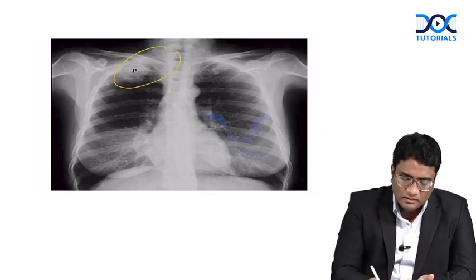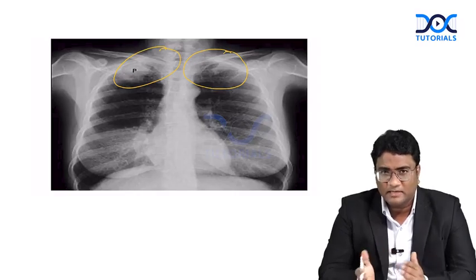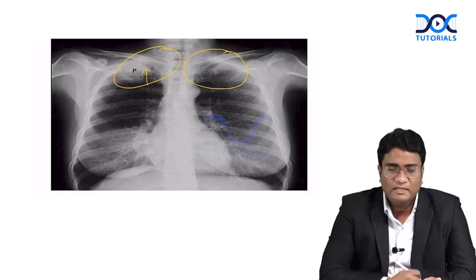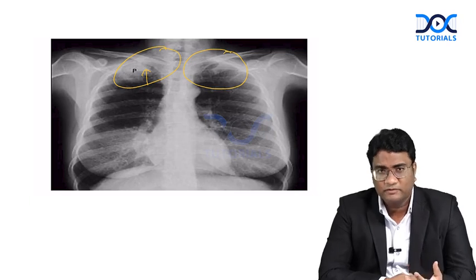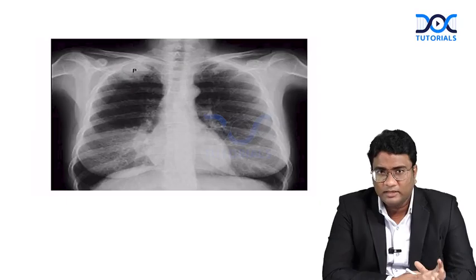So if you can see here, look at this. If you are not concentrating well while seeing the radiograph, you will miss this opacity. But if you follow the protocol, you look at the lung zones, apical zones, upper zones, middle zones, lower zones, and also try to look at the hidden areas of chest X-ray, you will pick up this opacity that is in the right apical region. This is your Pancoast tumor, right, which can invade the brachial plexus, subclavian vessels. It can cause erosion of the rib, erosion of the clavicle there. So this is your apical lung opacity that you are seeing. Usually the Pancoast tumor would be there. Lung cancer, apical lung cancer. So this is how you have to look at the radiograph bilaterally symmetrically to pick up the pathologies better.